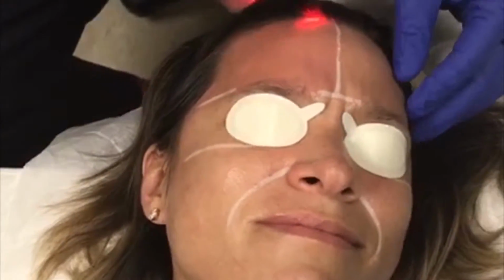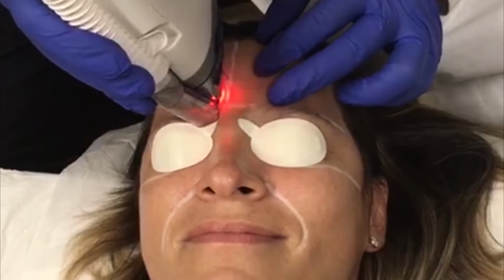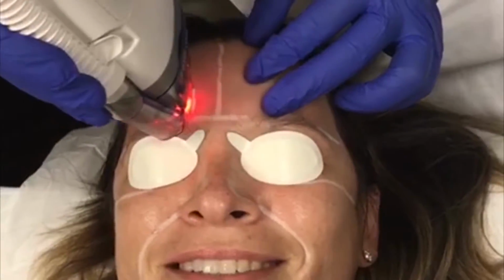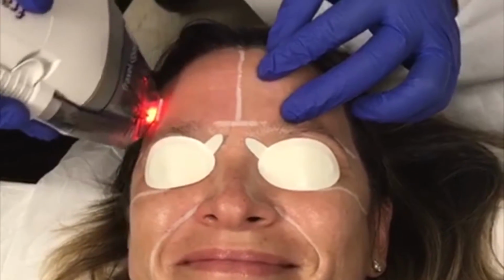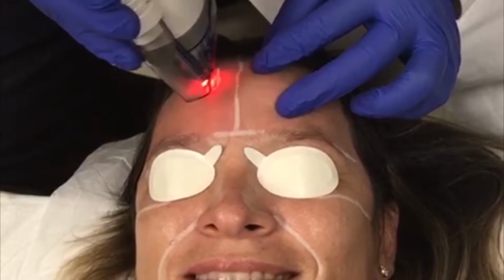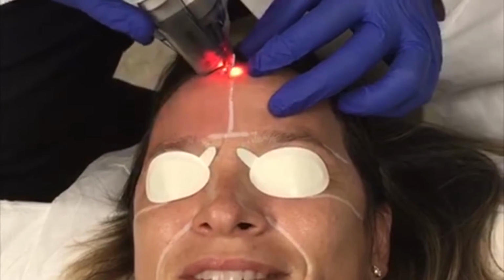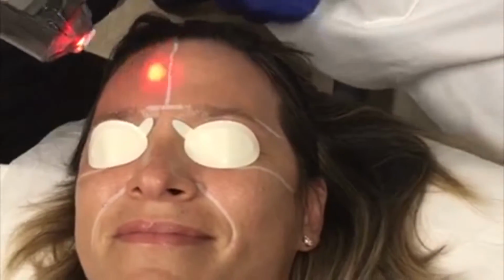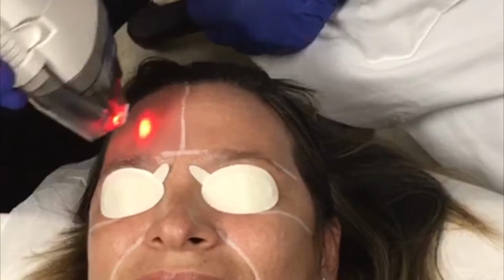One of the uses of this device that I've adapted more recently in my practice is using it for treatment of actinic keratosis. This is a useful procedure because patients get a cosmetic benefit as well as a medical benefit out of this treatment. And I do this procedure for both men and women with actinic keratosis with fairly good results. I also use this technology for treatment of keloids. I usually combine it with intralesional injections with Kenalog and use the 1550 wavelength of this laser to resurface the keloids and break up some of the collagen tissue.